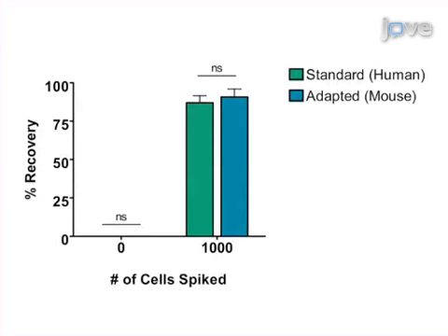Results obtained using the CellSearch system demonstrate that CTC analysis can be effectively performed in both human and mouse xenograft blood samples.